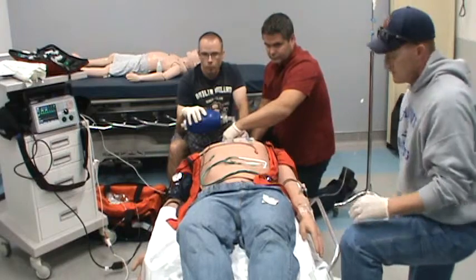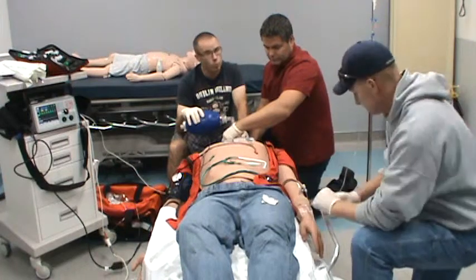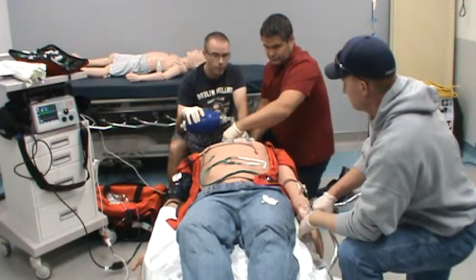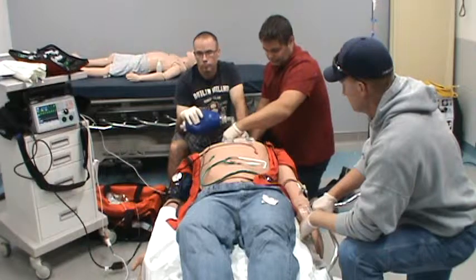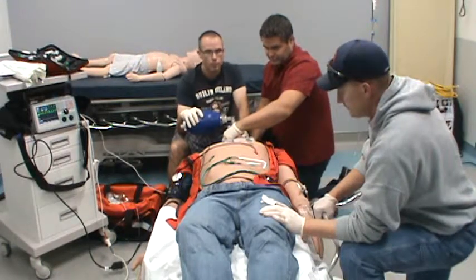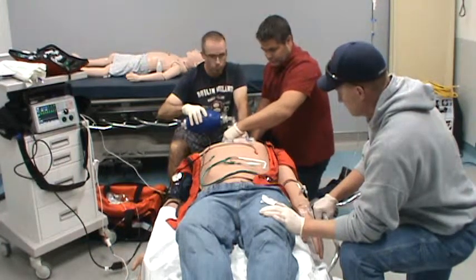This could be anywhere from 30 to 60 seconds. If we don't see any fasciculations, we'll just look for the breathing to stop and also check his jaw to see if that's limp. Okay, we have fasciculations. Remember, when I see where I need to go, just hand me the tube. Okay.